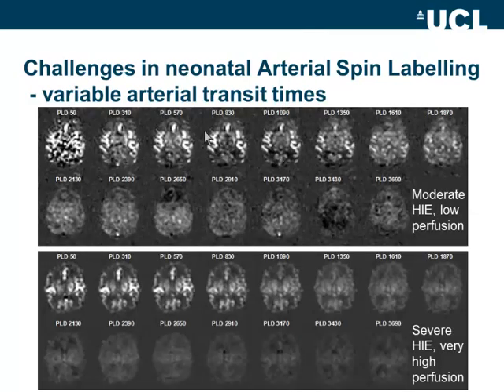Some of the studies that we've been doing compare two HIE babies, and we acquired the data at multiple post-labeling delays. In this case, it was a simple pulsed ASL with multiple post-labeling delays, to see when we see the perfusion, and when the large signal in the large vessel disappears. Quite interestingly, in a lot of severe HIE patients, and I'm sure my two colleagues will agree with me, you quite often see a very high perfusion. Ellen hinted that this might be related to the fact that cell death is completely undergoing at this point in time.